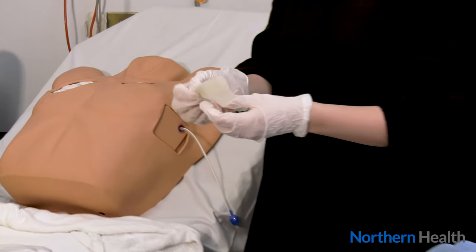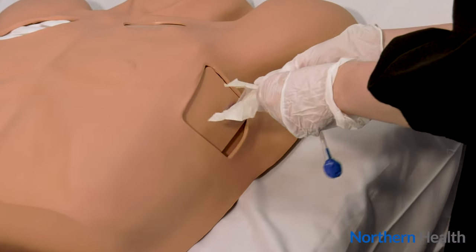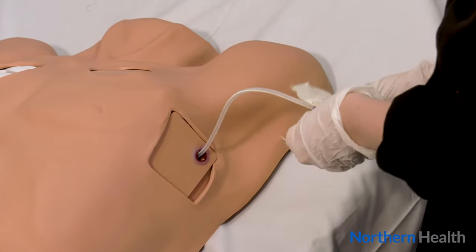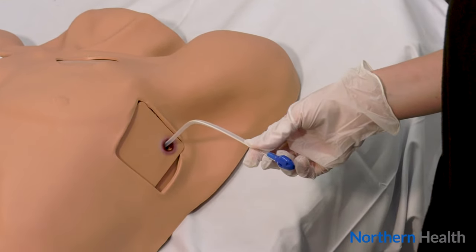Clean the catheter with the last swab by wiping down the tube and away from the wound. We don't recommend cleaning the wound with the alcohol swab. It is normal to see some ooze and a scab forming around the tube. If the wound looks very red or inflamed, is hot to touch, or has yellow ooze, it could be a sign that it is infected and you should contact the pleural phone.